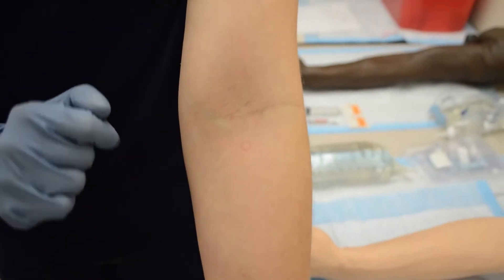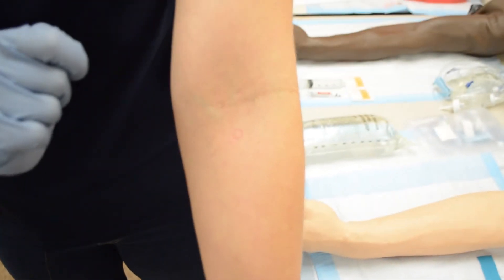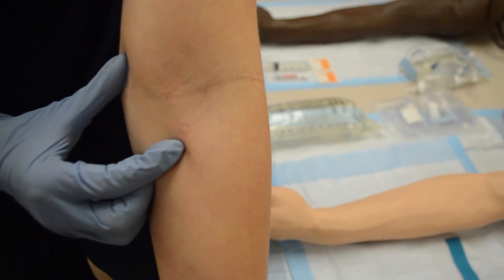Some veins also cannot be straight — sometimes they're set at squiggles. What we want to do is start at the bottom and try to hold taut, applying enough pressure to try and straighten out the vein as best we can.